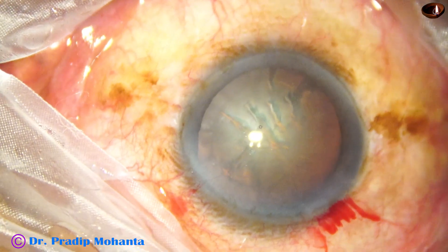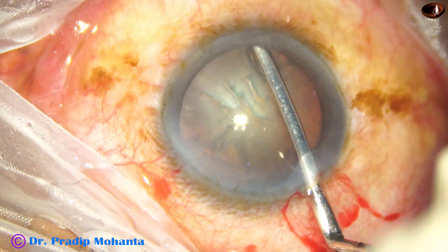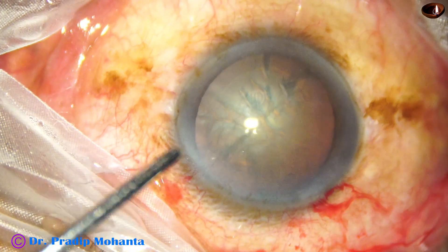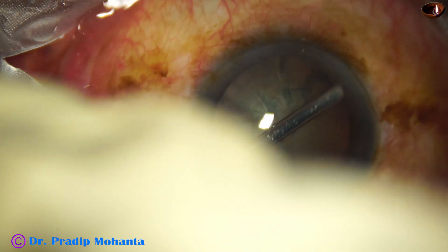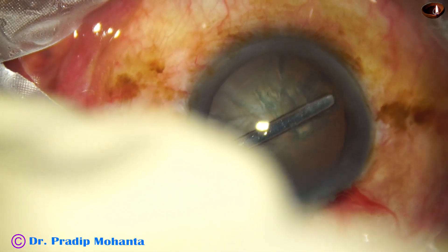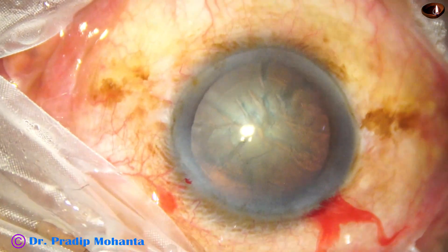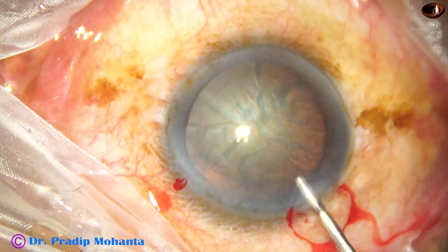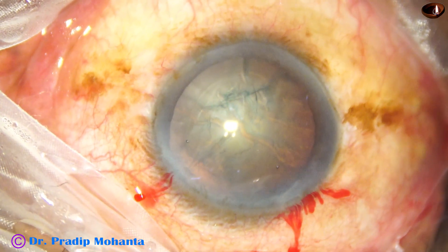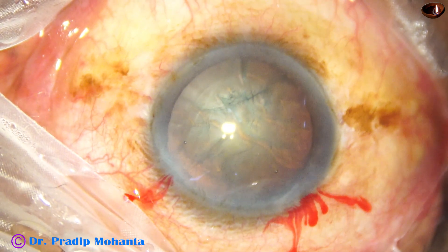Viscoelastic is injected, and now I am using an iris spatula to dissect the anterior capsule up to the equator using this blunt instrument. This is done, and now I have asked for the CTR. My assistants are getting ready with the capsular tension ring.